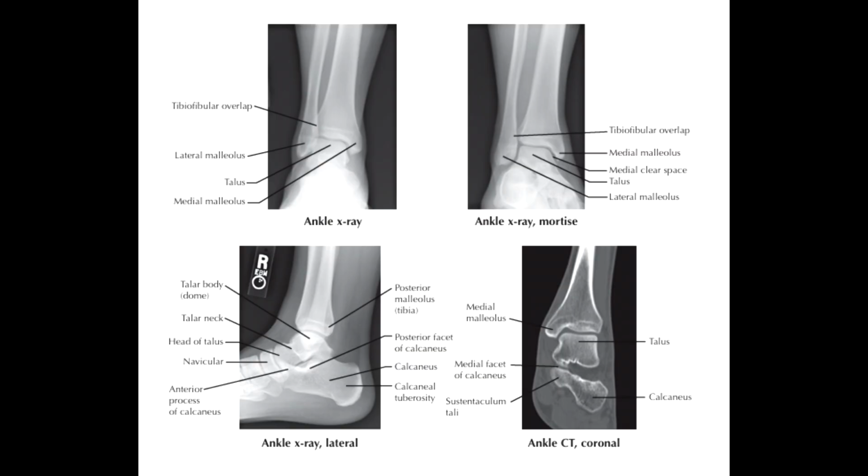So, radiology of the ankle and foot is not simply about identifying bones. It's about integrating anatomy with pathology using each modality, X-ray, CT, MRI, bone scan, for its strengths. Plain radiographs give us the first-line assessment. Stress views reveal instability. CT shows us the complex geometry of fractures. MRI unveils the hidden world of ligaments, tendons, and cartilage. And bone scans highlight bone metabolism before structural damage is evident.